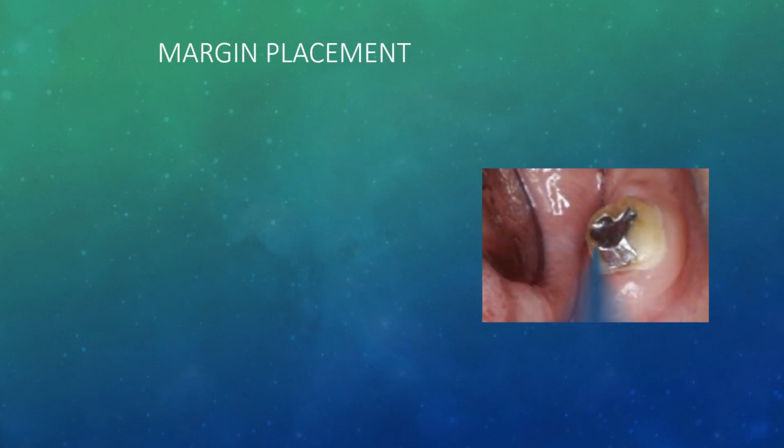And so once you have placed your margin at the equigingival level, that is where you can ensure that there is structural durability.